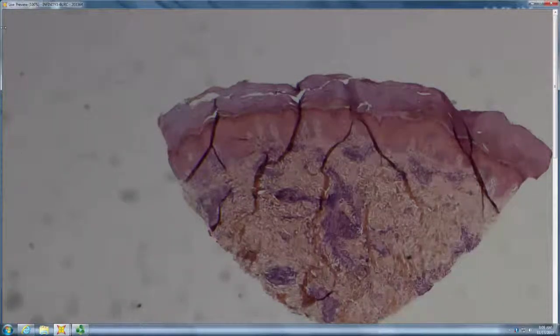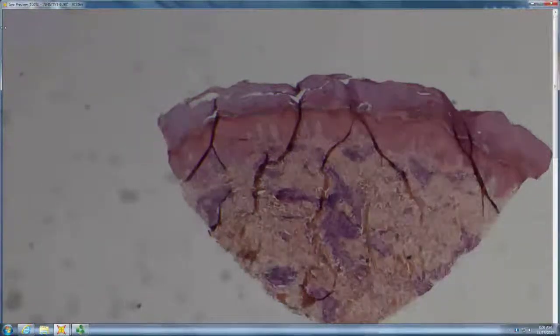And that's in the wrong box, the slide here. Okay. Looks a lot like the neutrophilic dermatoses. So you have neutrophils, karyorrhexis. It's a big, broad, sort of nodular and diffuse infiltrate. You've got papillary dermal edema. So what are your neutrophilic dermatoses?